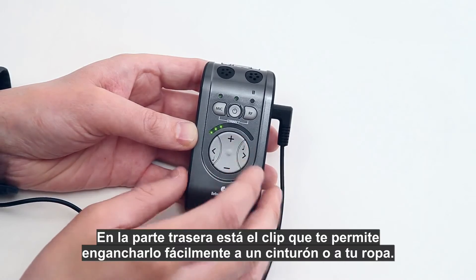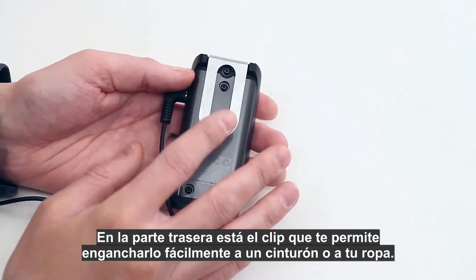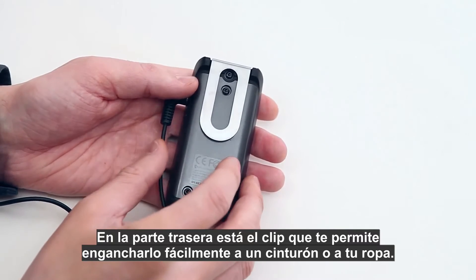On the back side is the belt clip, which allows you to easily attach the unit to a belt or on your clothes.